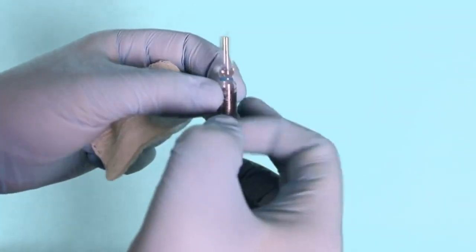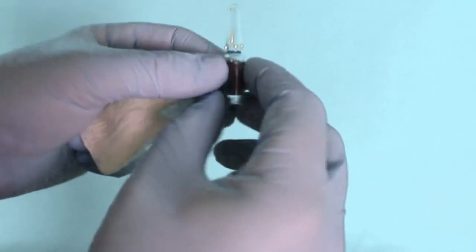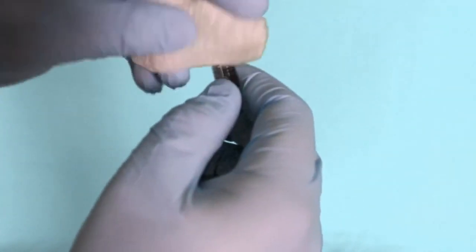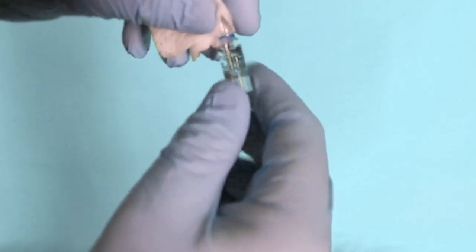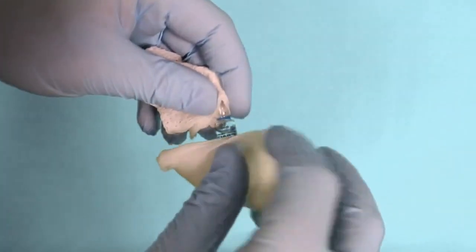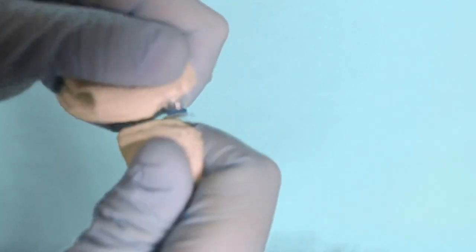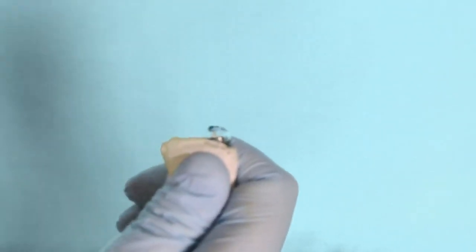First, it is important to know how to open an ampoule of epinephrine. To do this, we have to break open a sealed glass ampoule. A good technique is to wrap one piece of gauze around the narrow part of the ampoule and another piece around the fat part of the ampoule. Holding the ampoule upright, snap the ampoule open by pushing the top away from us.